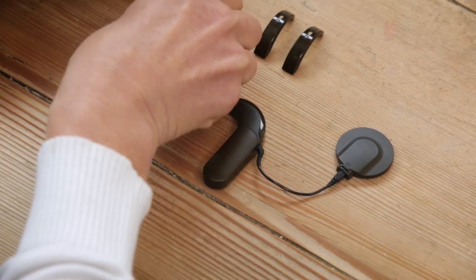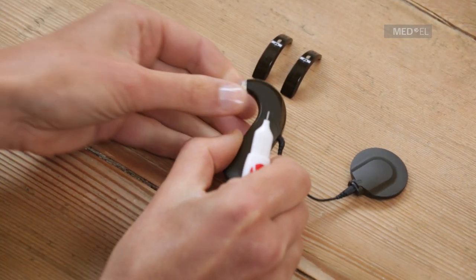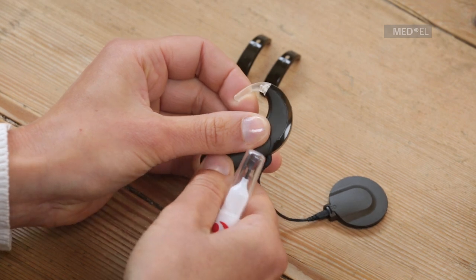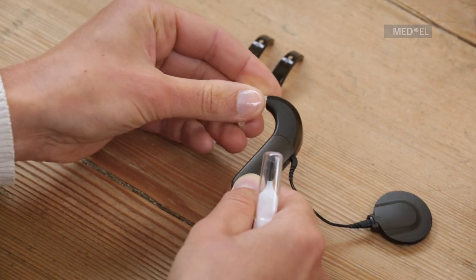You should replace the SONNET microphone cover if it appears dirty or if you notice a change in sound quality. You should change the cover every 3 months for the best sound quality. To replace the microphone cover, remove the ear hook.